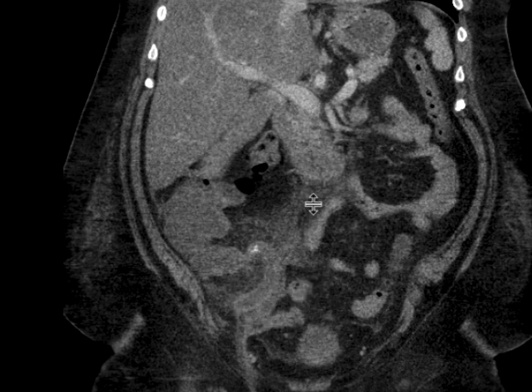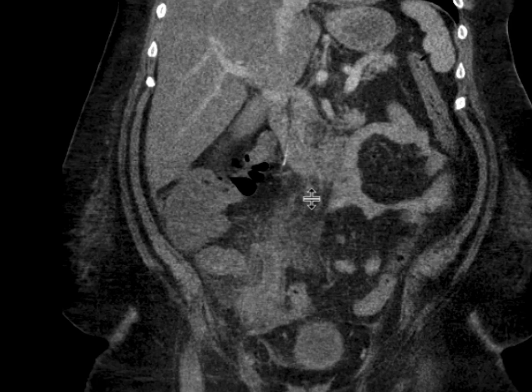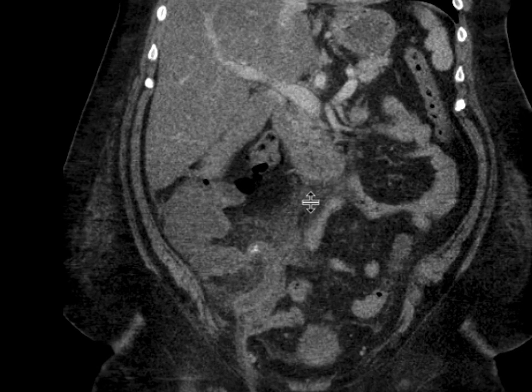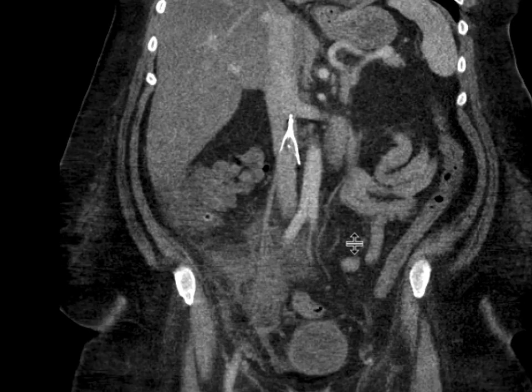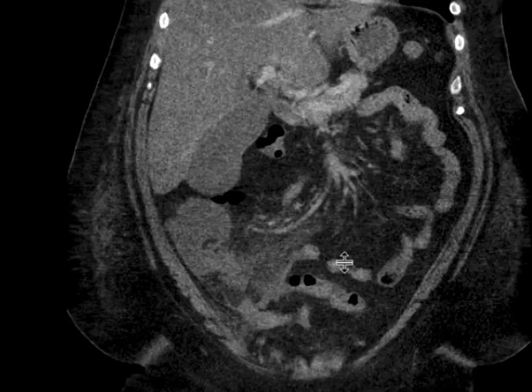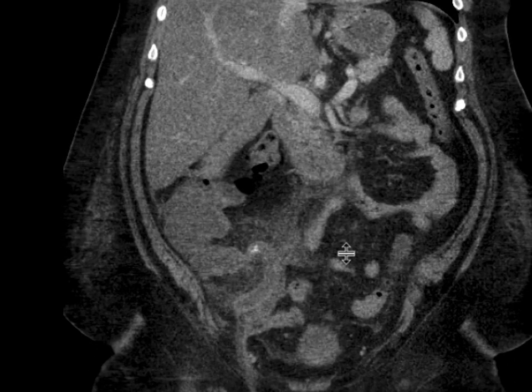This finding is compatible with acute appendicitis. There is an appendicolith — this high-density structure at its base that's causing the obstruction. This patient went to the operating room and was indeed confirmed to have acute appendicitis.